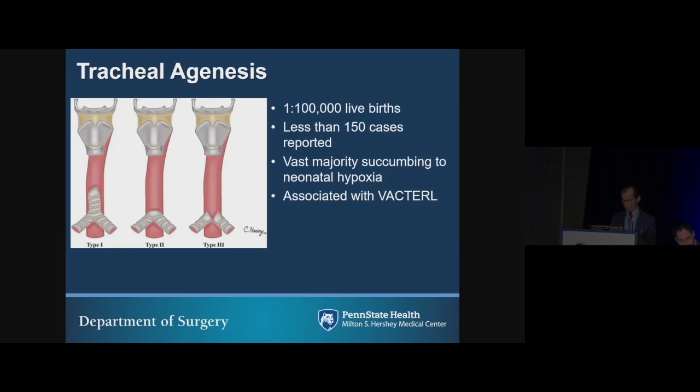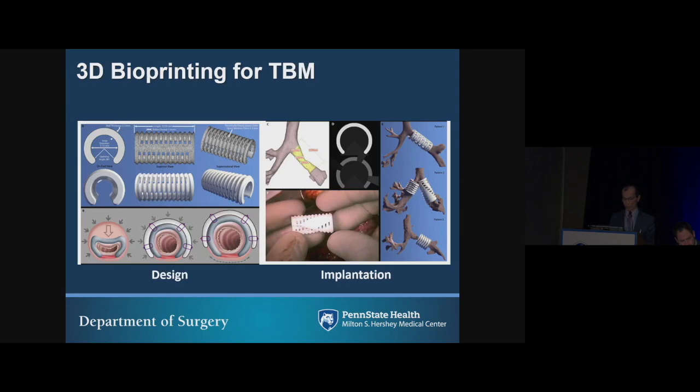They have a publication of more than 20 patients that have successfully been applied using this treatment, and there's only one mortality in that 20 plus patients. In terms of their complication rate, it's comparable to intraluminal stent and other surgical options. In fact, there's no erosion risk, and granulation tissue is not a significant concern in this patient population.